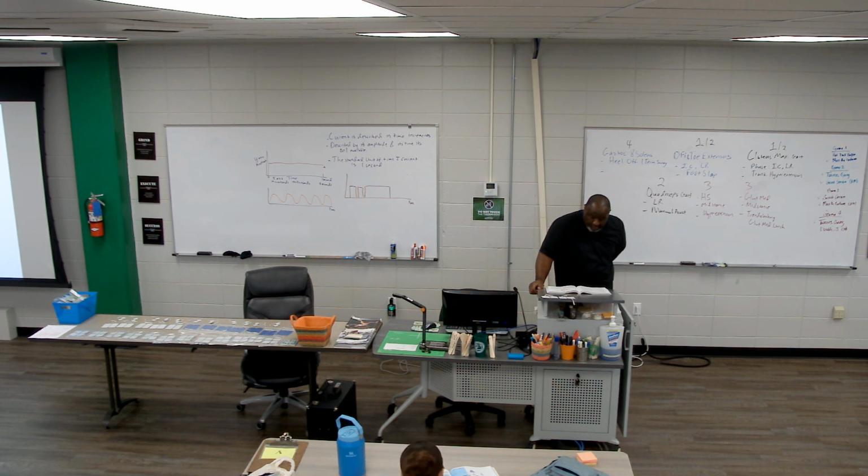Down at the bottom of that, it says oscilloscopes are devices used to monitor electrical waveforms, and they can visualize what is actually happening. So you can connect it to an oscilloscope. We don't do that. We don't have any desire to go that deep into it. We will choose ours based on the objective of what we're trying to accomplish. So monophasic, biphasic, polyphasic.